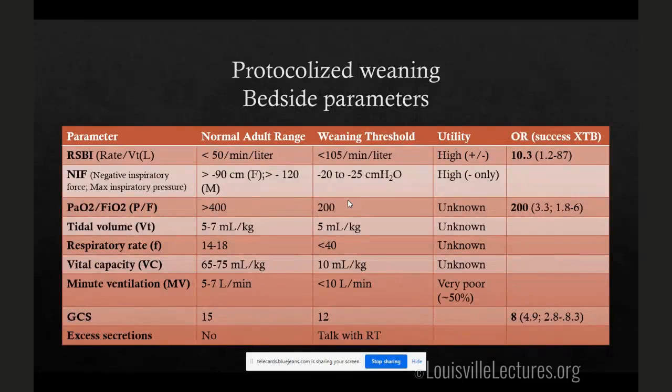so that they don't keep stacking and building up from there. That way you support every breath they get with that additional PEEP, so that they're inflating and deflating the entire time. So the keys again to auto PEEP: if they're crashing, disconnect them from the vent. If they're early, consider up-titrating the PEEP to match what you're seeing based on the PEEP sensed. And finally, for obstructive lung disease, lower the respiratory rate because you need to increase time for exhalation.